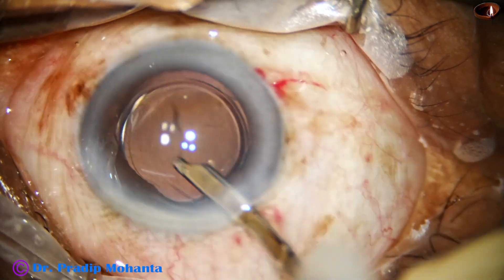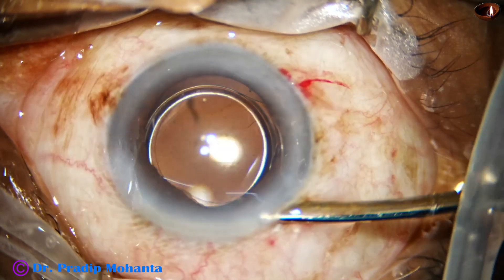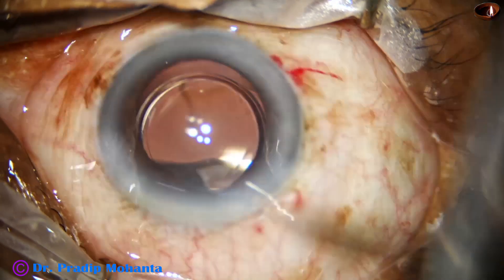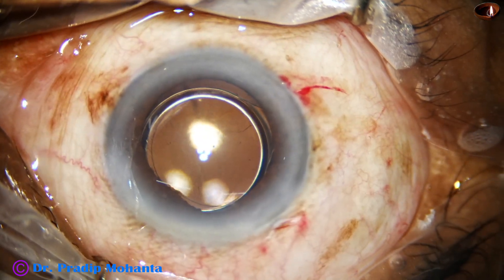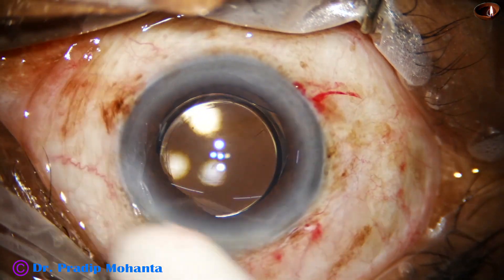And the lens is oriented nicely. Then the anterior chamber is formed nicely. Integrity of the wounds is checked. Few drops of moxifloxacin are applied over the ocular surface and the case is concluded.